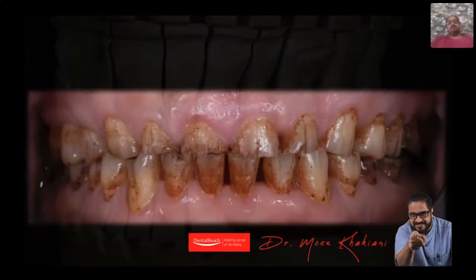Imagine doing a patient like this. I know the first thought that comes to your mind is, oh my God, I will have to give this patient bruxzir crowns. I will have to do monolithic zirconia crowns, else the patient will break anything. Please don't do it. When you put something that is so strong into the patient's mouth, the weakest link becomes the human body. If zirconia is so strong, the weakest link in the human system will give way. Be rest assured. I love saying this.